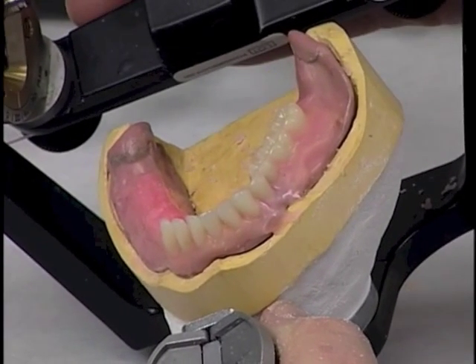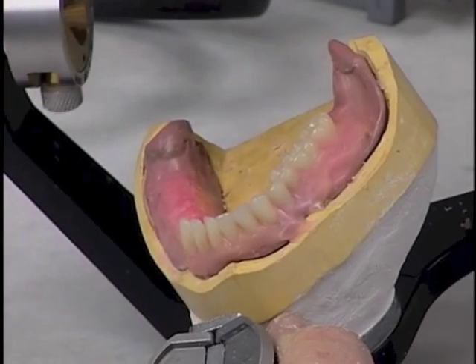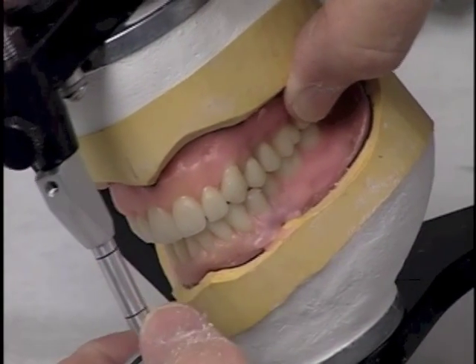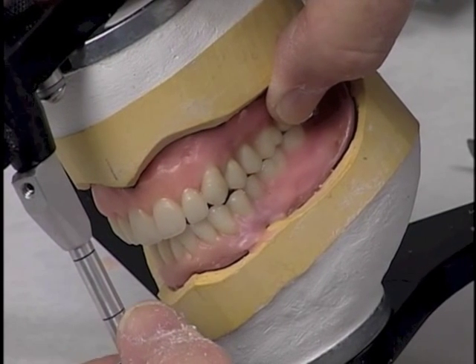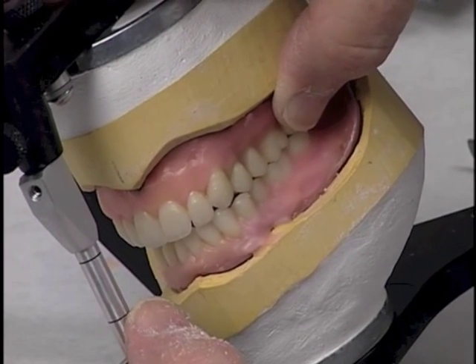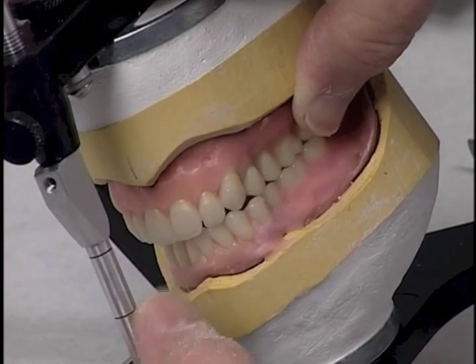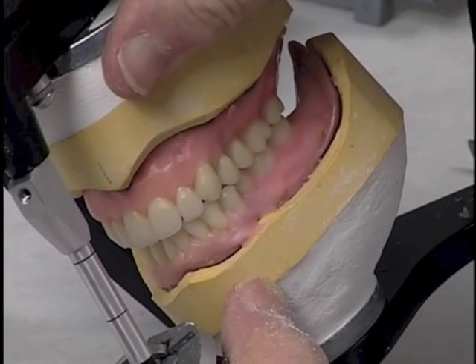And now we have the teeth arranged for the left side of this particular case into nice group function of all of the slopes of the cusp and cusp tips in proper position.